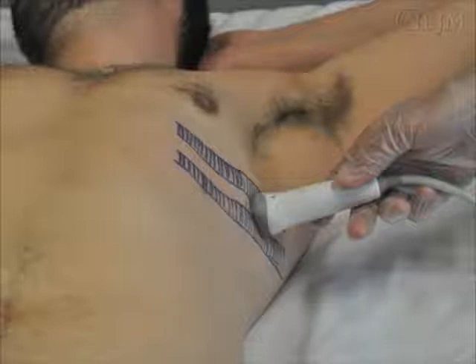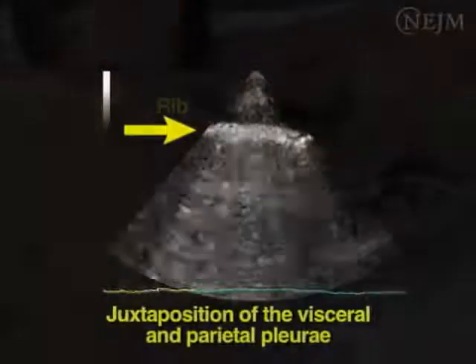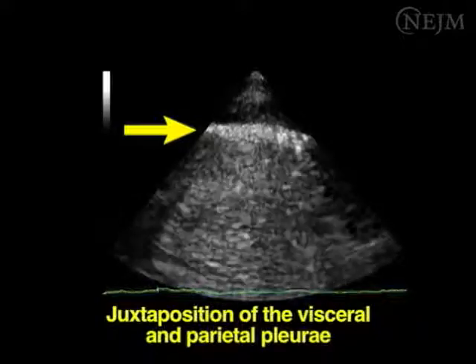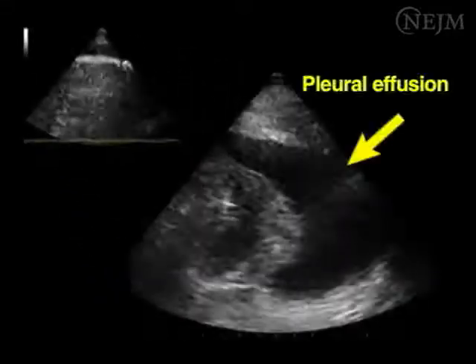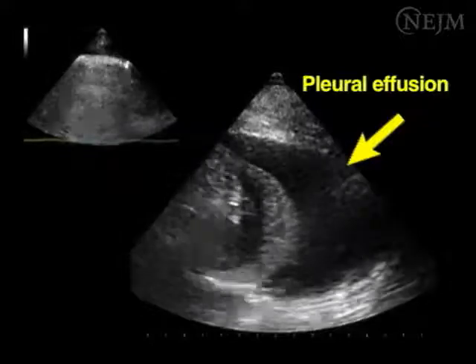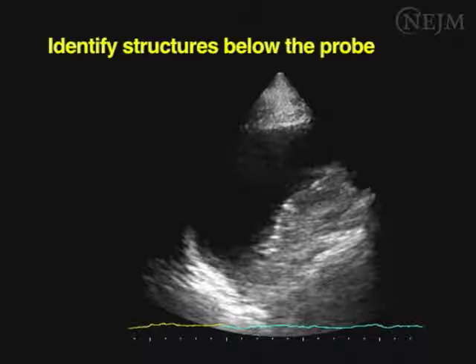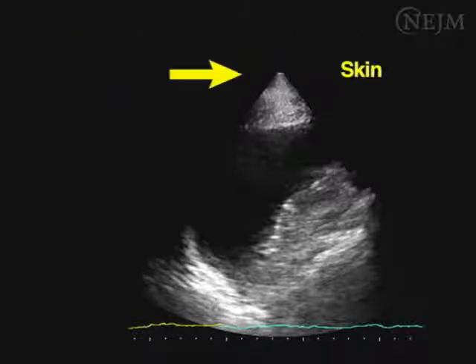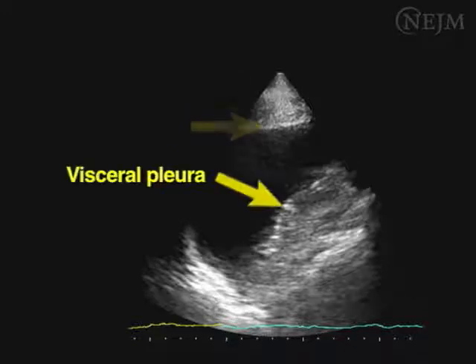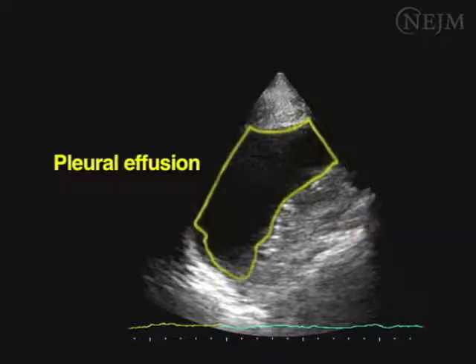Position the ultrasound probe in parallel to the intercostal space, holding it firmly and perpendicular to the chest wall to obtain the best acoustic window. Normally, the visceral and parietal pleura are juxtaposed and moving with the respiratory cycle. In contrast, the pleural effusion is shown as an anechoic space between the two pleura. The optimal acoustic window should provide clear visualization of the entire ultrasound field, identifying structures from surface to depth: the skin, muscles, parietal pleura, visceral pleura, and lung parenchyma.